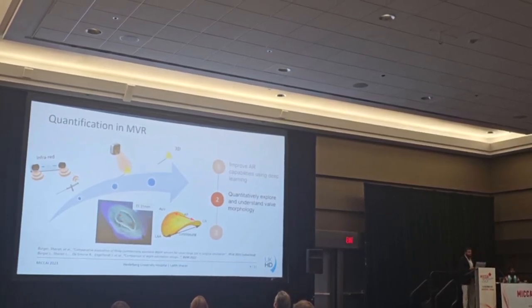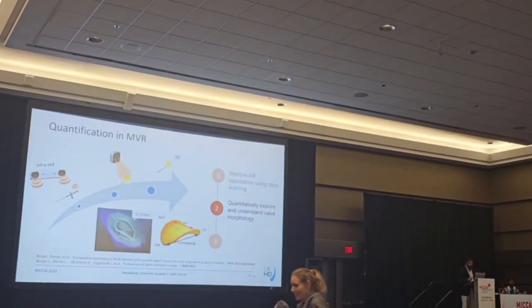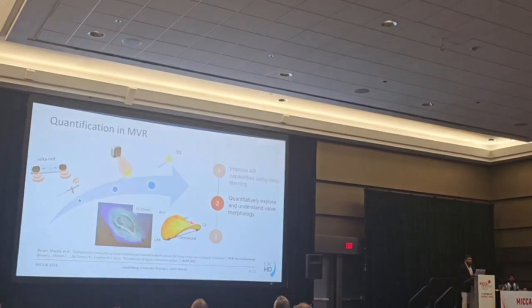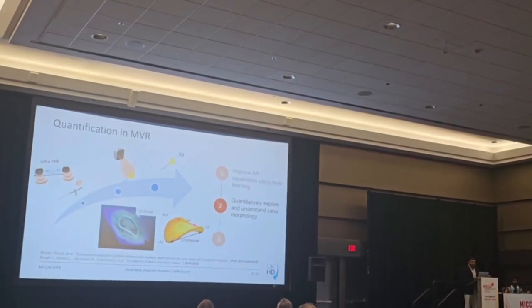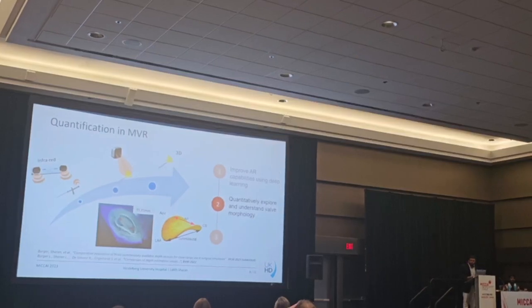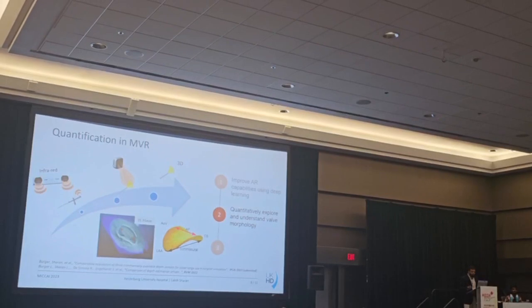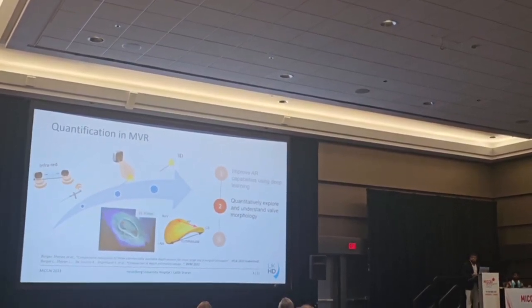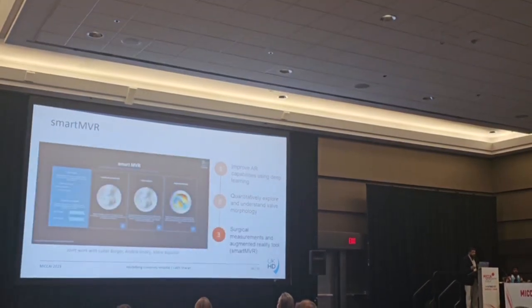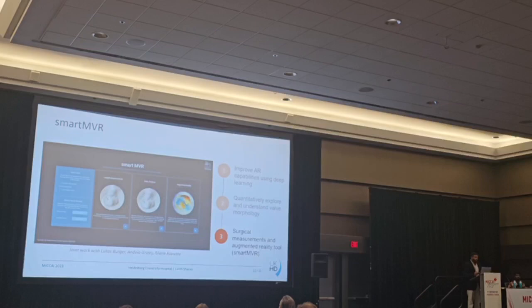And previously this was done using infrared sensors, but as part of my PhD we also found a method that works with a commercially available sensor in close range for this application, and it's ongoing work to completely get rid of the sensor, to just use the endoscopic images to reconstruct the valve so that we can make these measurements.